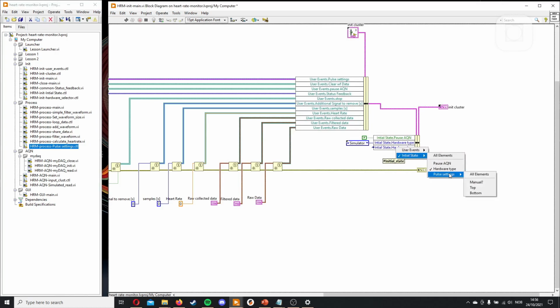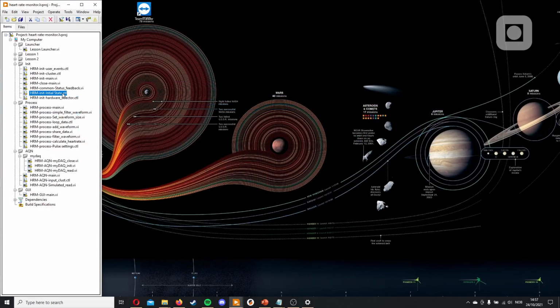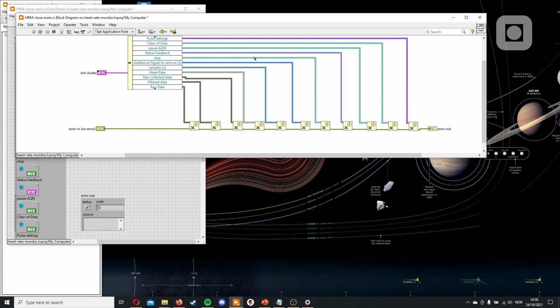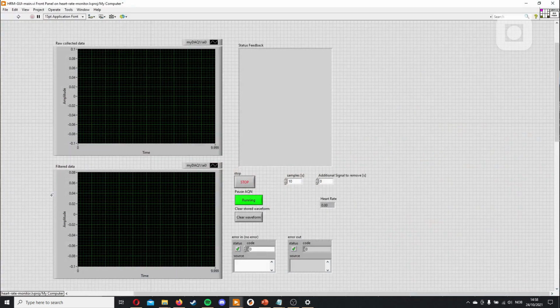So we don't need to care about top and bottom as they are unknown. We could at a later date define them if they're very common. And then initial manual, no, we want auto. Now we need to go into close to fix this. We can now add this functionality to the GUI. So let's do that.